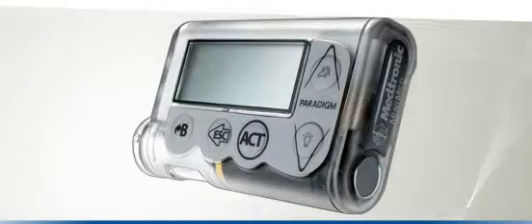Let's find out a little more about the menu screens on the Paradigm VEO and how you can navigate through them. You may find that some of the menu items we refer to in this section do not appear on your Paradigm VEO. If your sensor is turned off, for example, none of the sensor sub-menu items will be visible. Don't worry, this is normal.